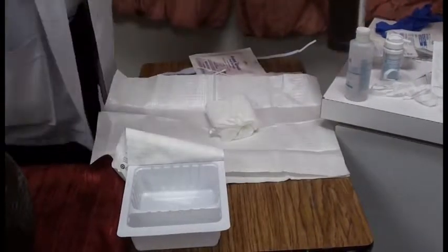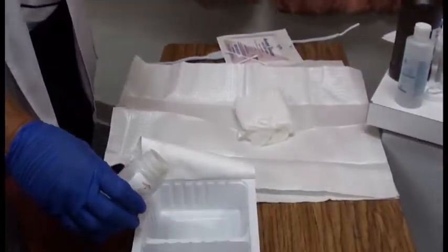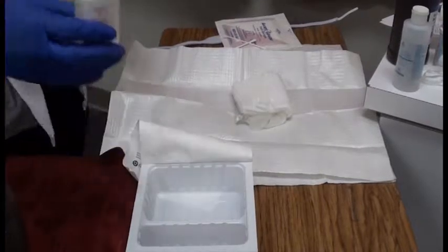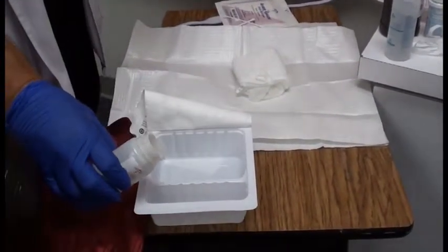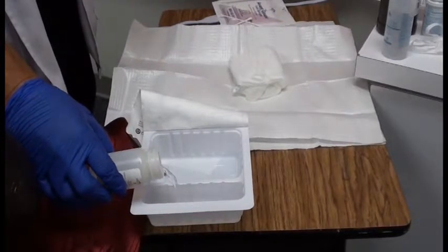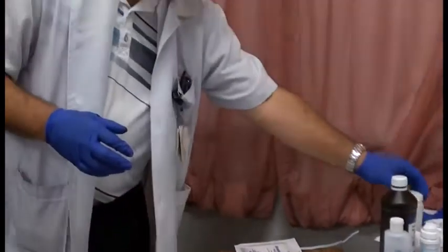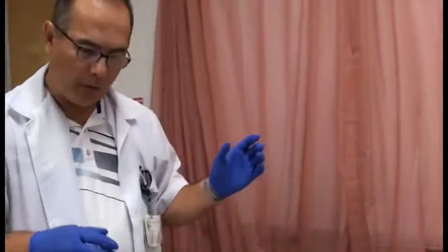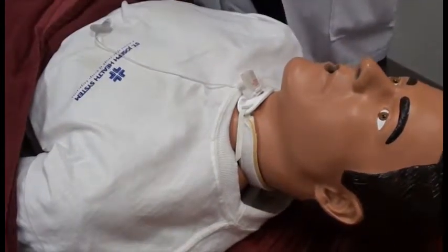And then we're going to follow that with normal saline, diluting it to half strength, about 1/2 inch to 1 inch. And then on a smaller compartment, we're just going to pour saline. Okay, put that away. Now I'm going to go to my patient and I'm going to remove the drain sponge that's here. I'm going to remove that, dispose of that.